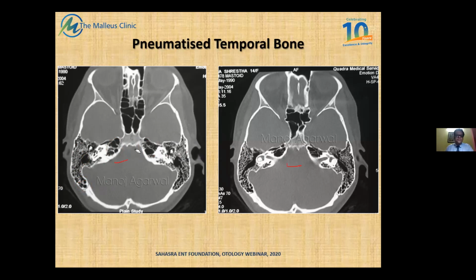it is bilateral. Now, an important part about the petrous apex is that whether it is sclerotic, whether it has bone marrow, or whether it is grossly pneumatized, it's usually bilaterally symmetrical. Very unlikely does it happen that you have pneumatization on one hand and marrow on the other, or pneumatization on one hand and a sclerotic petrous apex on the other. And these scans prove the fact that the pneumatization is usually symmetrical.